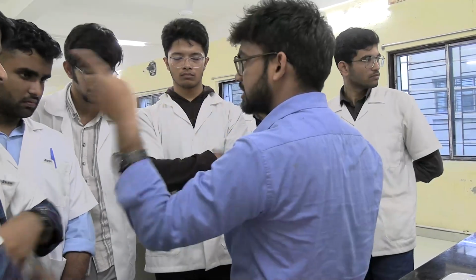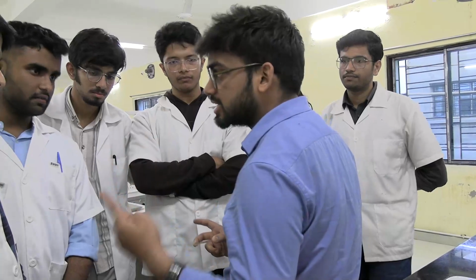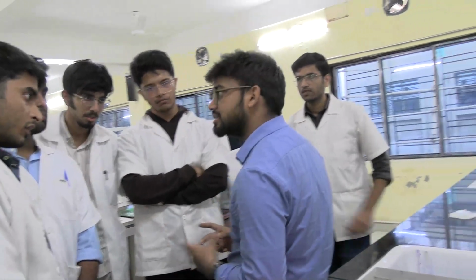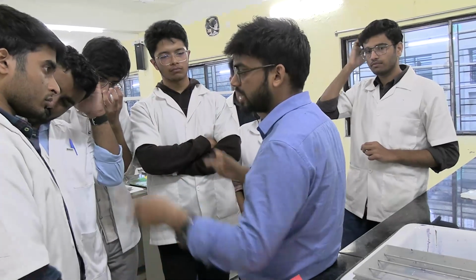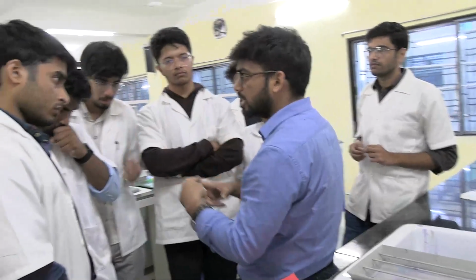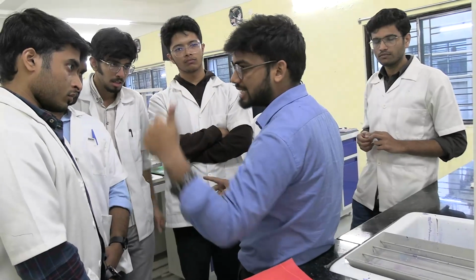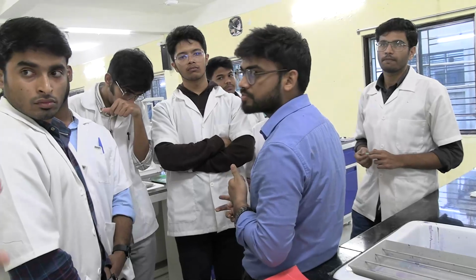First, how many cells can you count? 100 cells. Suppose in 100 cells you get 10 eosinophils. What is the percentage? 10%. Okay, so it's easy now. That's why we calculate 100 cells. For 100 cells you can make a box, and for small lymphocyte you can write SL, for large lymphocyte you can write LL. How can we identify that it's 100 cells?